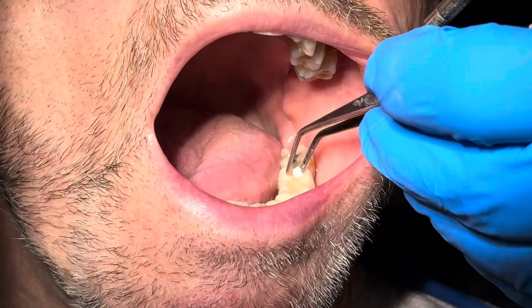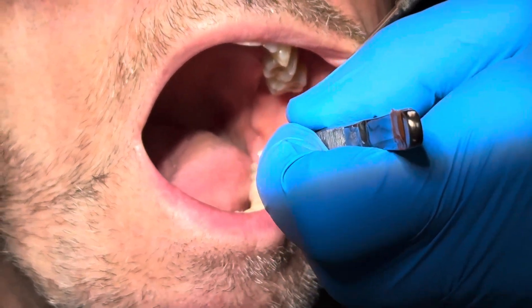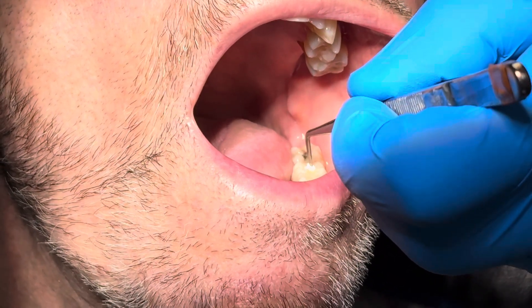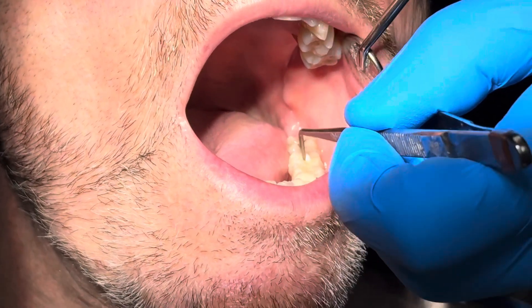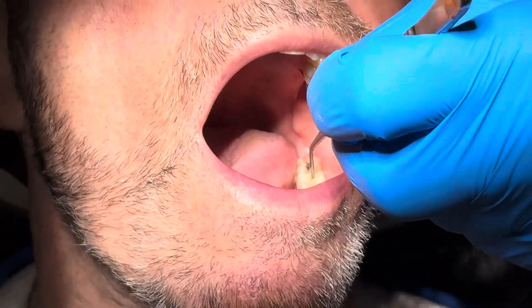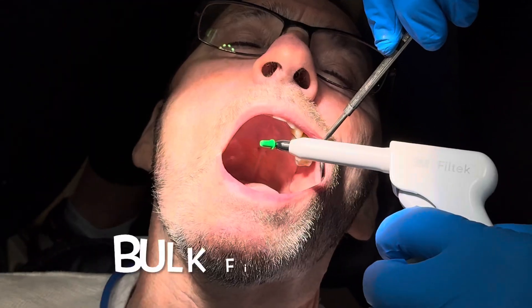It's a very simple and easy procedure and the patient really doesn't mind it. There isn't a lot of pressure on the soft tissue or discomfort, and the bite comes back usually perfect because you're doing it on articulators that allow it to be perfected.